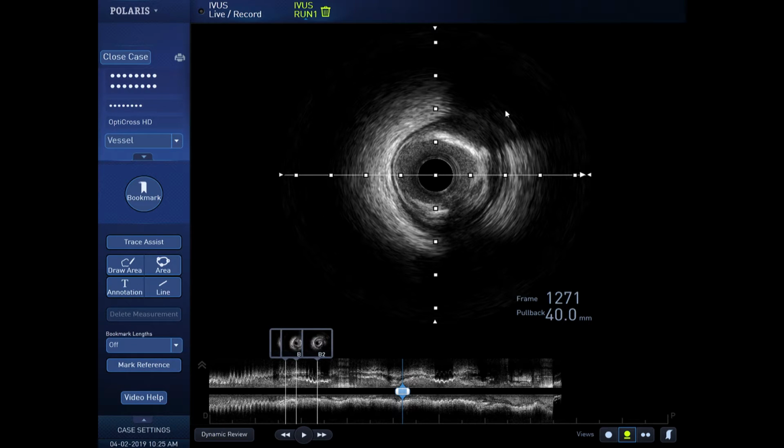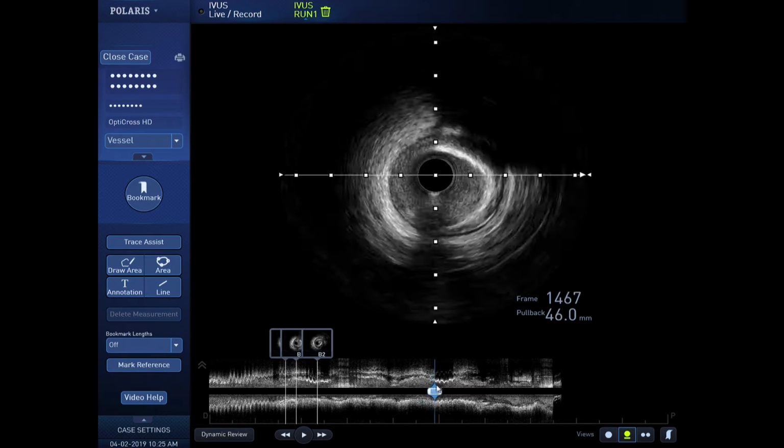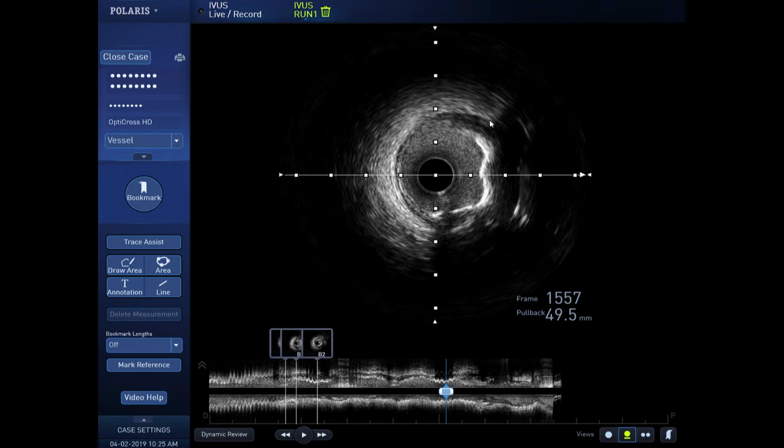Angiographically, if you look at it, you do see mild calcium. But when you see mild calcium in a vessel like this, with a long lesion, you should always consider more. Now here this is calcium. Go back. This is nice. You see that? You don't see a lot of the vessel behind. About a 150-degree arc, between maybe 2 o'clock and 6:30 at most.